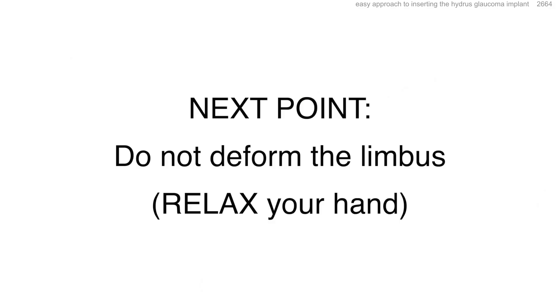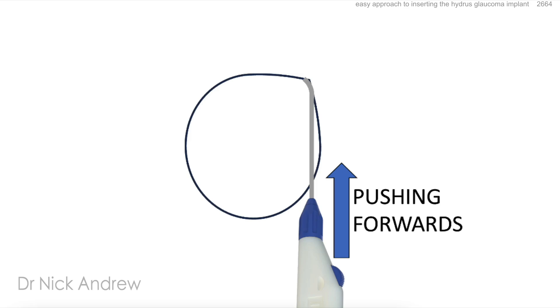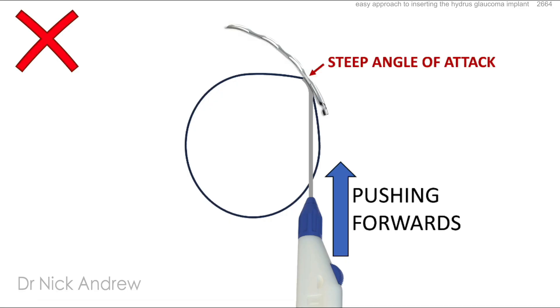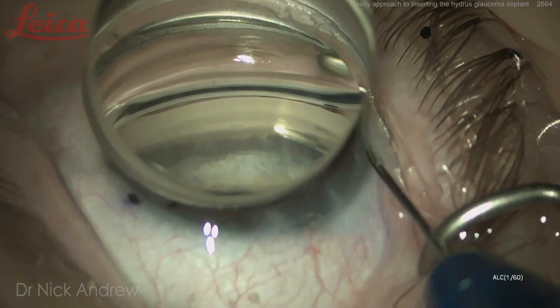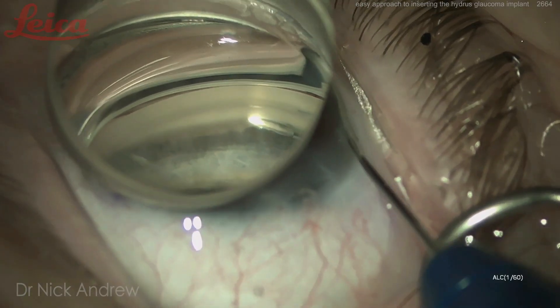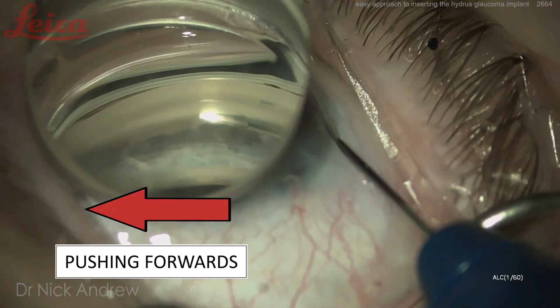Next point: do not deform the limbus — you must relax your hand. If you're pushing forward with the Hydrus injector, you'll deform the smooth curve of the limbus into a corner or apex, which has the same effect of causing a steep angle of attack. Here, I've just pierced the trabecular meshwork as far to my right as I comfortably can, and now I'm going to push forwards.